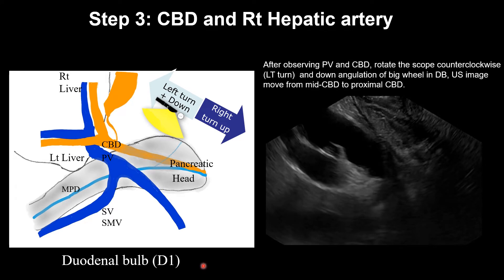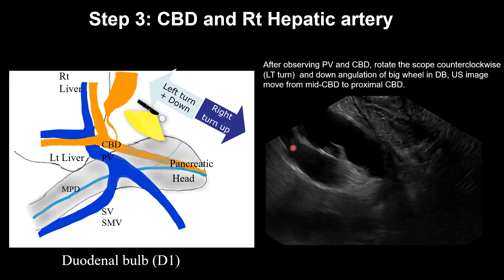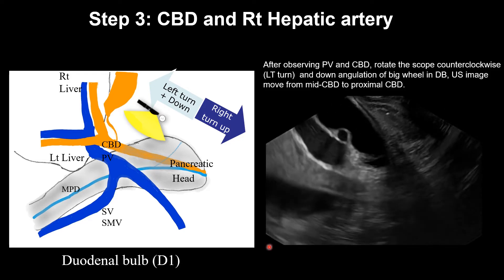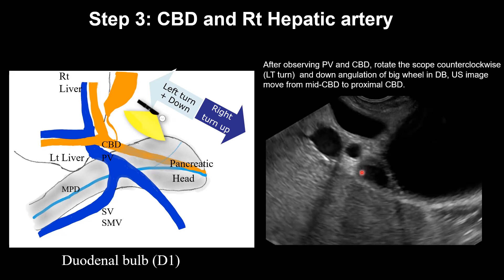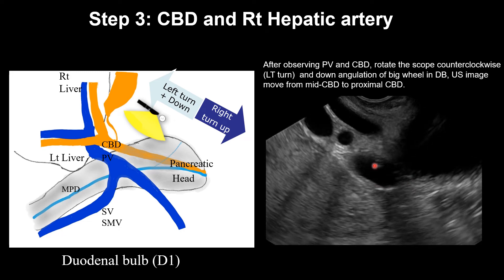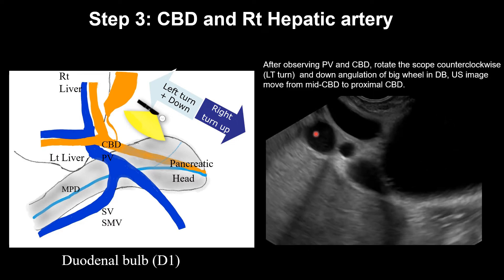Step 3: CBD, right hepatic artery, and gallbladder in this area. Left turn and downward of the scope — we can see the mid-CBD and portal veins. On ultrasound imaging, this is the distal CBD, right hepatic artery, and this is the portal vein. We can see the CBD and cystic duct. Following the cystic duct, we can see the gallbladder neck area and body area. This is the portal vein.